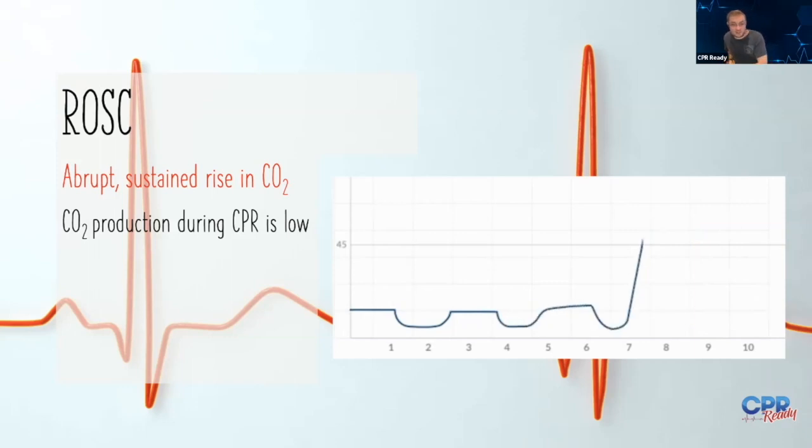Now, if it looks like what I'm showing on the screen right now, say you've just given sodium bicarb, and then you see a few big, tall spikes like that. Does that mean ROSC if we've just given an amp of bicarb? You'll see an increase in CO2 that's very transient. If you're working a cardiac arrest and you give an amp of bicarb, pretty quickly, once that circulates, you're going to get some increased CO2 because the metabolism of the bicarb produces some CO2 that's going to get measured.